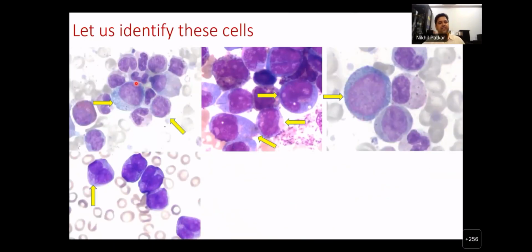Now, this particular blast has a lower nucleocytoplasmic ratio. That simply means that the cytoplasm is abundant in these cells. They don't have a lot of granules, but the nucleolus is prominent, and these cells are also myeloblasts, but they are shortly before they start differentiating towards promyelocytes. Cells like this have prominent nucleoli, but their nucleus is now indented, and you have this pale discoloration here, known as a paranuclear hof, and these are actually promyelocytes. But cells before that stage are myeloid blasts, which are committed to the myeloid lineage but have yet to become promyelocytes.